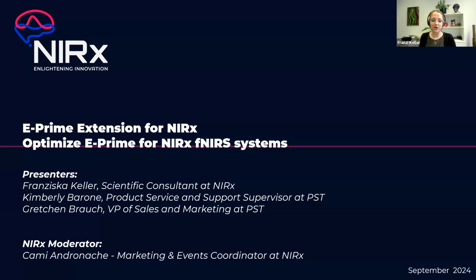So today we want to talk about the wonderful ePrime extension for NIRx, which is a new product that we have developed in collaboration with our colleagues at Psychology Software Tools, or PST, who are also joining me here today. I'm also joined by our wonderful event and marketing coordinator, Cami, who is working in the background to ensure that everything is working smoothly.